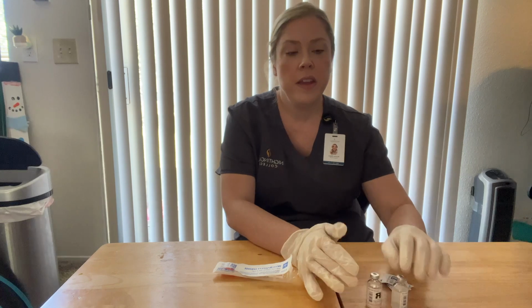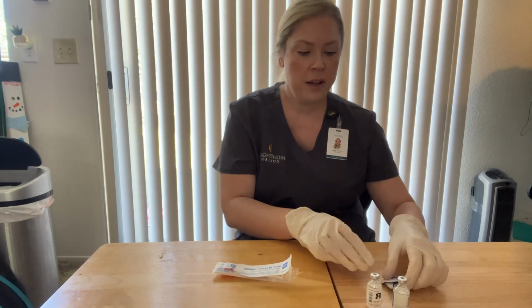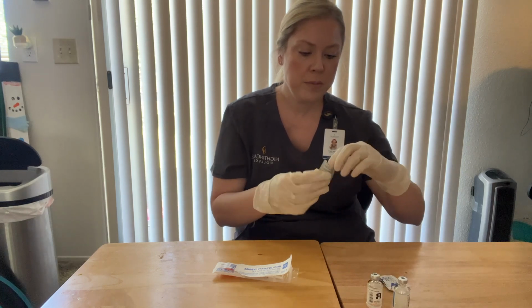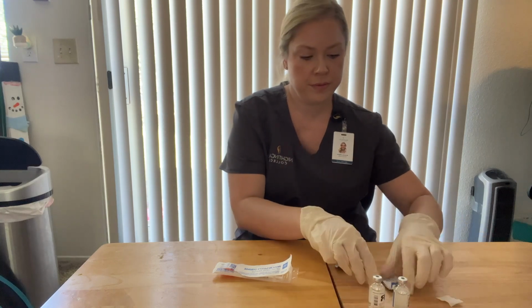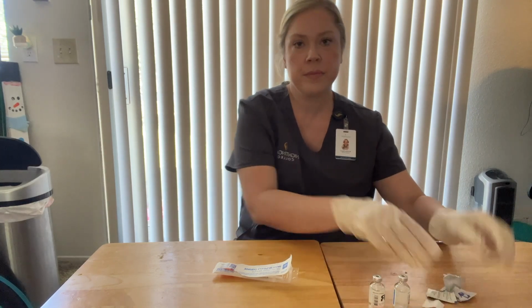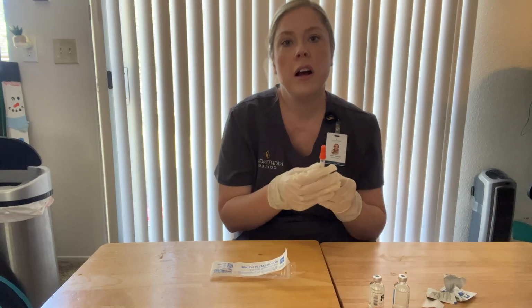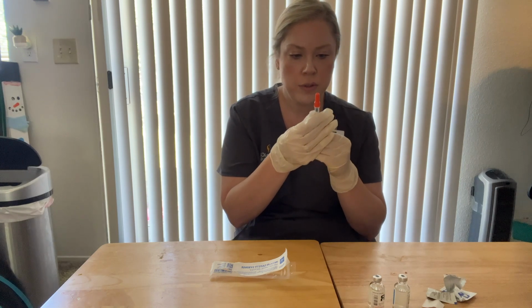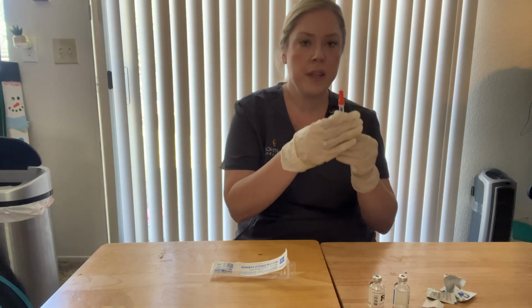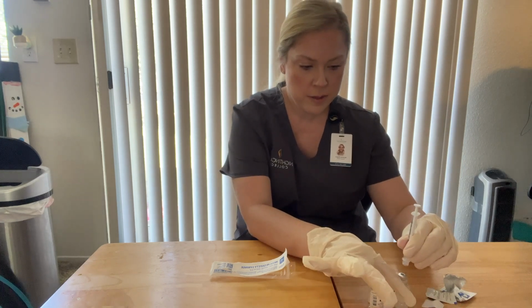I'd want to make sure that the regular insulin was clear, and the NPH is generally cloudy, so a little cloudiness is okay. I would want to open up some alcohol wipes and wipe the tops of each vial. I have a 1 milliliter syringe. I'd want to withdraw 8 units of air and push that into the NPH, making sure not to touch the needle to the actual medication when I disperse the air. So we'll go ahead and do that.